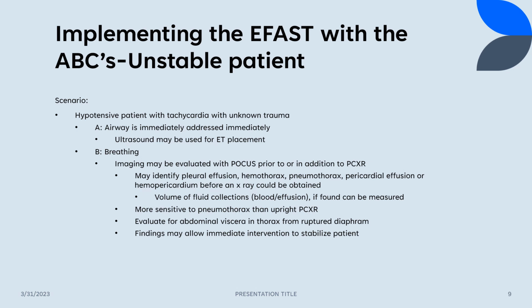Now we're going to take a look at exactly how EFAST can be incorporated with the ABCs in patient care, to see how exactly this would be utilized to optimize the patient outcome. And these scenarios are going to be supported by information in the point of care ultrasound text recommended for the course by Soni, Arntfield, and Kory. So if you have further questions or need more specific scenarios to help guide you, that is a great resource to look at.